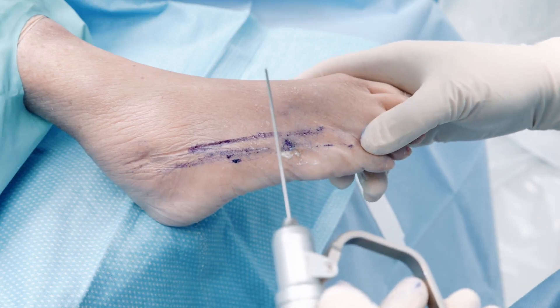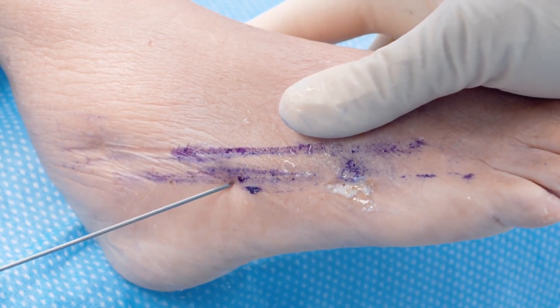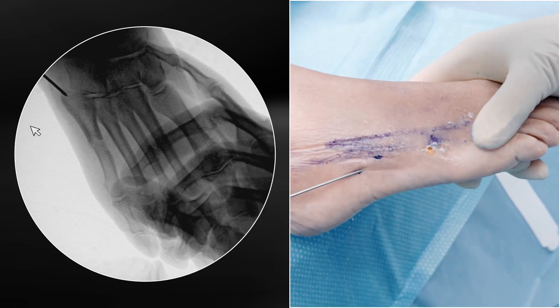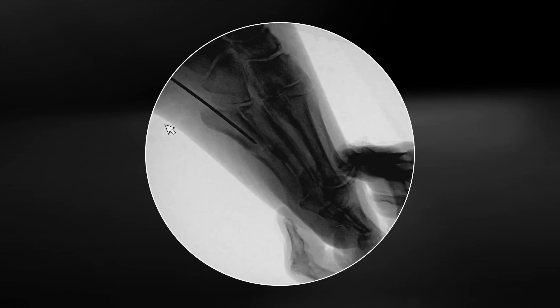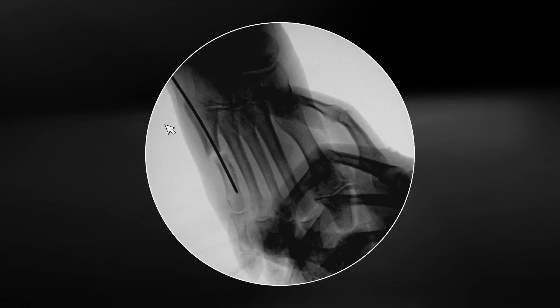This guide wire is a little bit easier to work with — it's the 1.6 millimeter guide wire for the 4 millimeter beveled screw. Because it's 1.6 millimeters, it's going to be a lot easier to get the direction I want. I'm literally starting at the 5th metatarsal styloid and driving it into the osteotomy line, ideally hugging that medial cortex when I get to the osteotomy. Now it's simply going to be a function of moving the metatarsal over and driving the guide wire across the osteotomy in an intramedullary position. You can see how putting the guide wire in this trajectory across the osteotomy site actually forces the 5th metatarsal medially, effecting your correction.